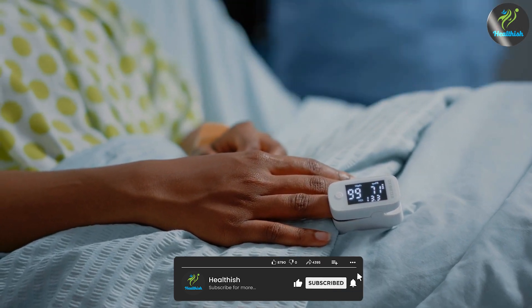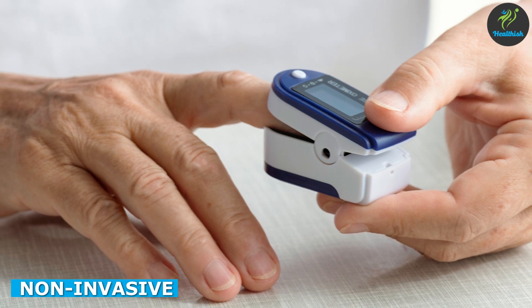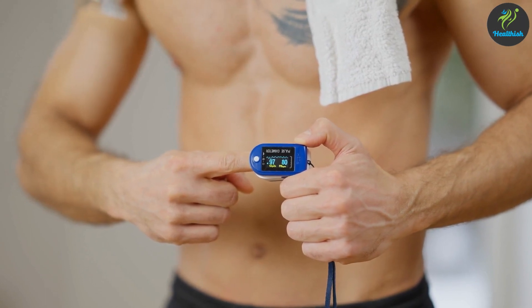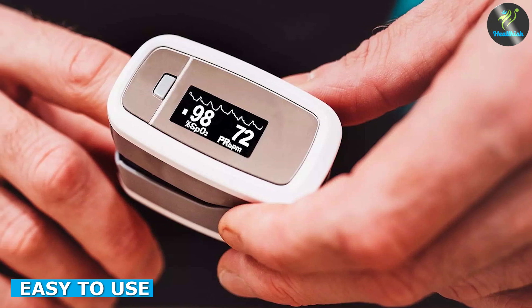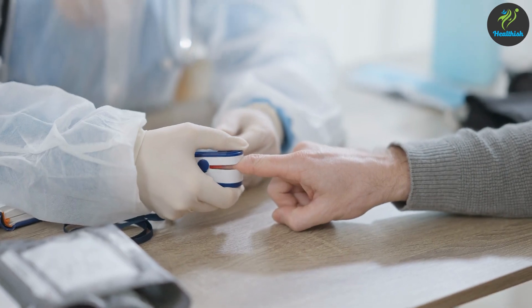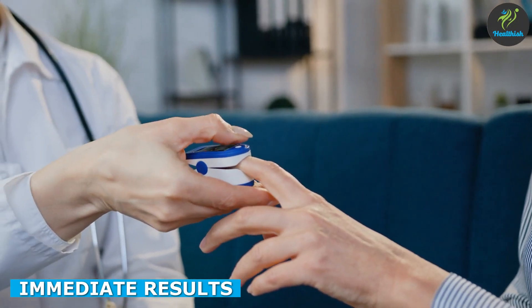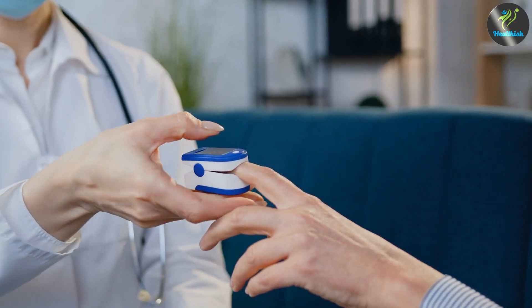What are the potential benefits of a pulse oximeter? First, it is non-invasive — it does not require a blood sample, making it a safe and painless way to monitor a patient's oxygen saturation levels. Pulse oximeters are easy to use and require minimal training. They are often used in home health care settings as well as in hospitals and clinics. A pulse oximeter also provides immediate results, allowing health care providers to quickly monitor oxygen saturation and make any necessary adjustments to treatment.